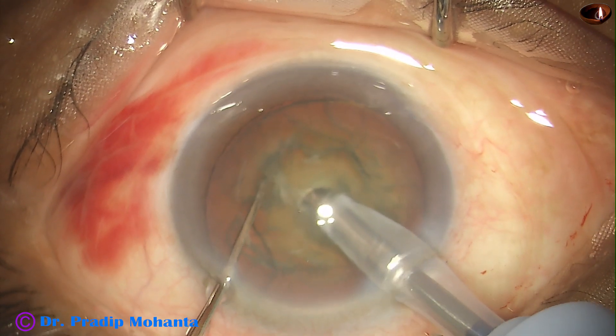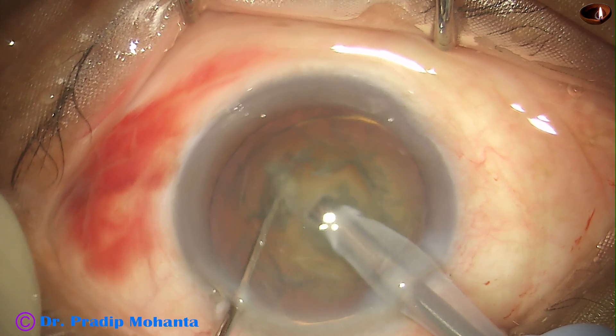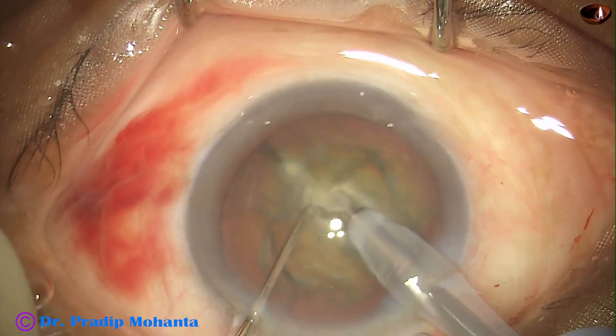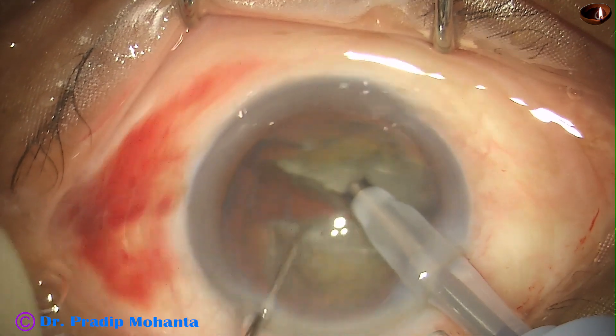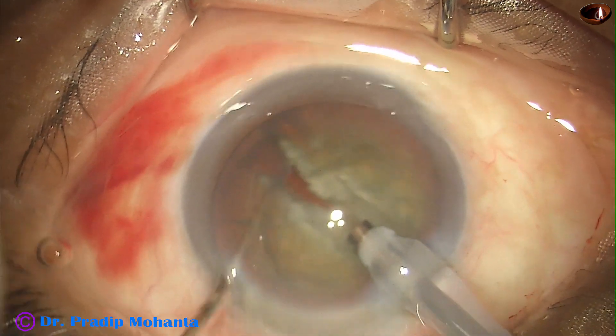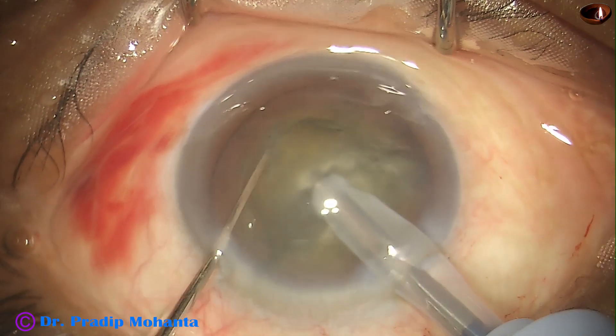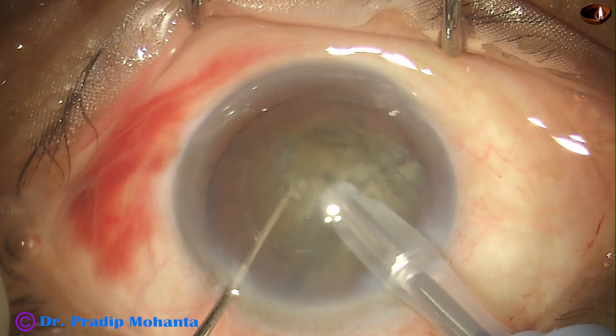See the submarine view with this microscope. The nucleus divides completely into two halves. Now this hemi-nucleus is again divided into two halves.